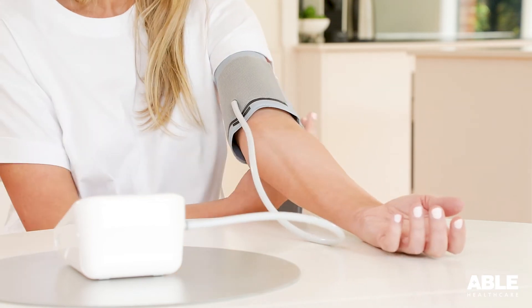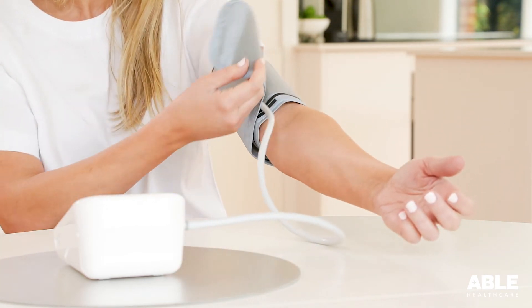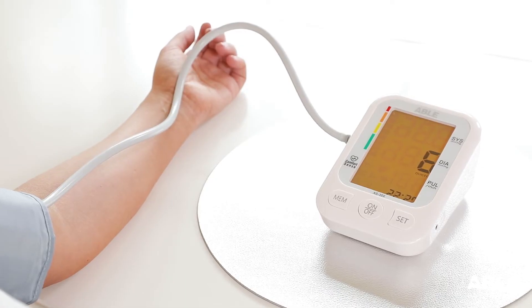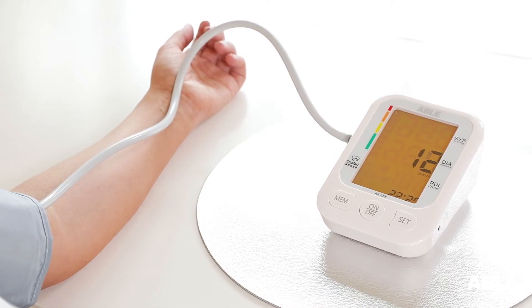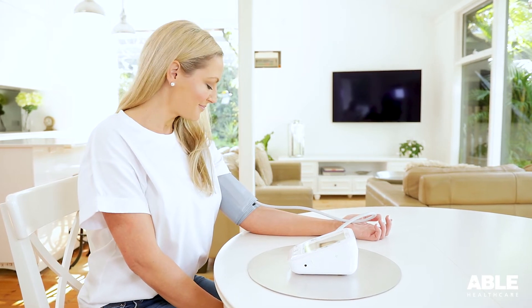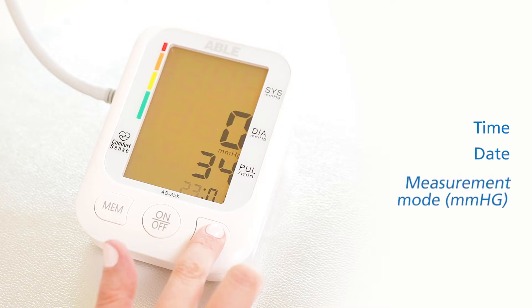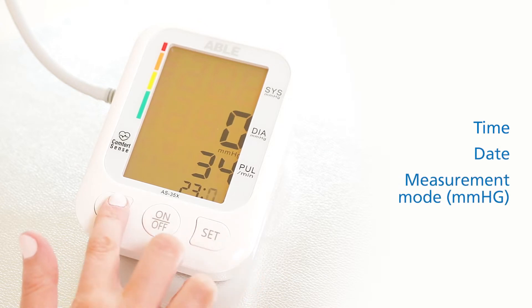To achieve the most accurate readings, it is best to follow your doctor's recommended testing schedule under the same conditions, following the same correct procedure at the same time each day. Firstly, ensure you have set the time, date and measurement mode by reading the instructions.